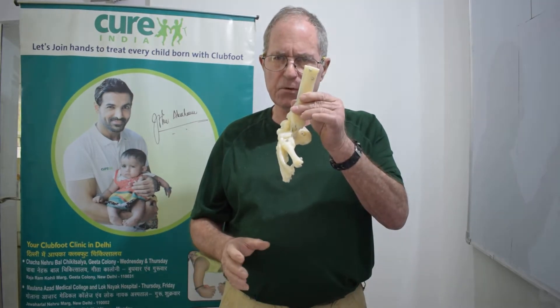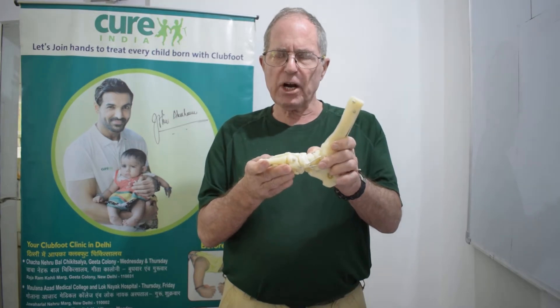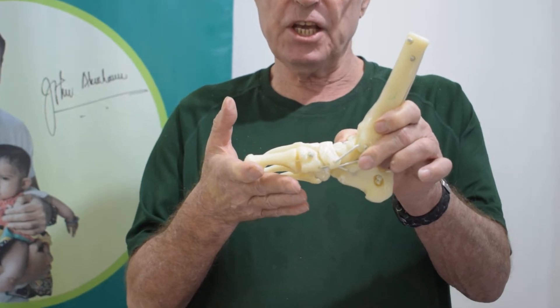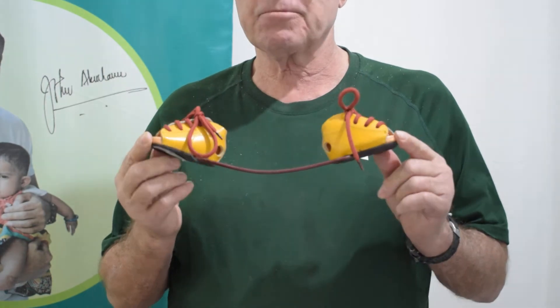In the first stage of treatment, casting corrects the faulty positions of the foot. In the second stage of treatment, the bracing maintains and protects, preserves the corrected position of the foot. Bracing is absolutely essential to the success of a correction program.